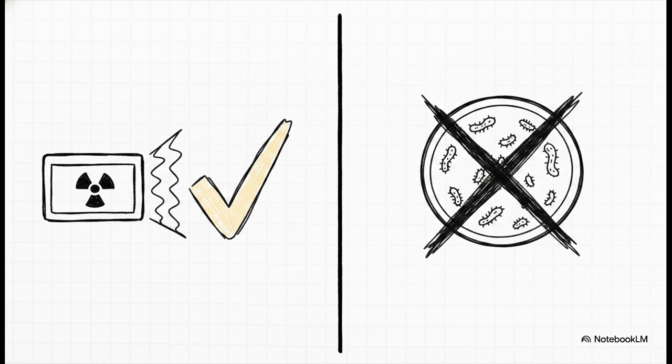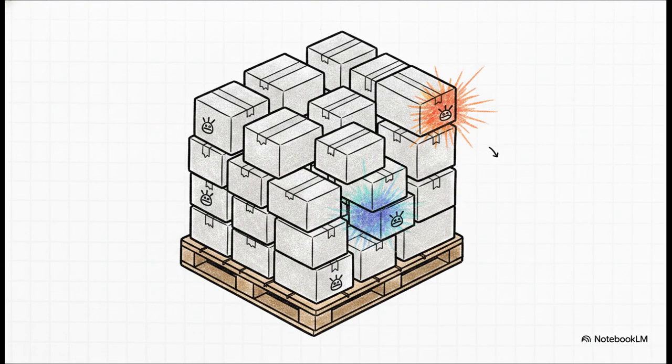I mean, think about it. We don't need to see the biology die if we can just directly measure the physical agent that kills it. Let's see how this builds in practice. During performance qualification, or PQ, we map out the actual loaded product. We place dosimeters everywhere to find the exact hot and cold spots in that specific density configuration.